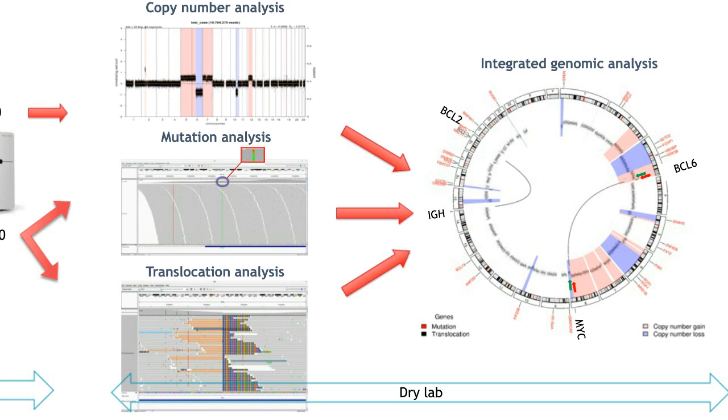We also see that the other side of the break-apart probe, the green part, also has gains, but at a lower level, so we only see 3 spots there. And for the MYC translocation in this case, we also see a gain for MYC, so you see 4 red dots, and then we see 1 green dot together with a red dot. That's basically the wild type chromosome still intact, but there's only 1 of them, so we only see 1 green spot. Now, if we only had that FISH, we would never be able to interpret exactly what's happening there.